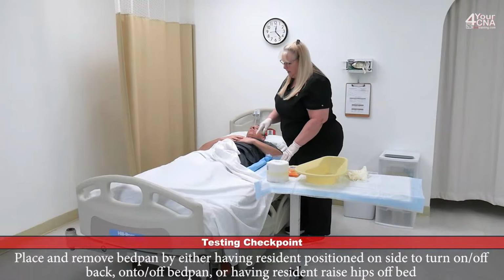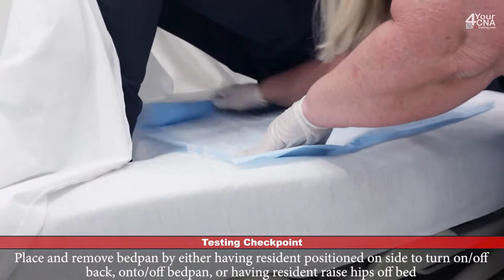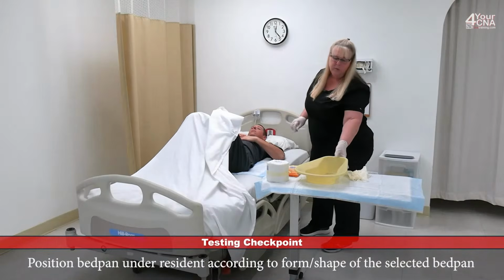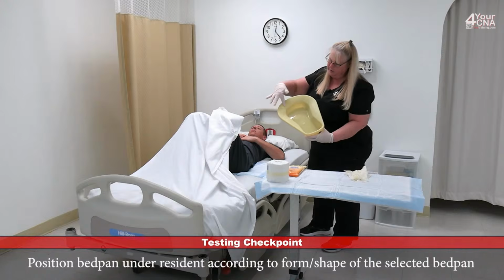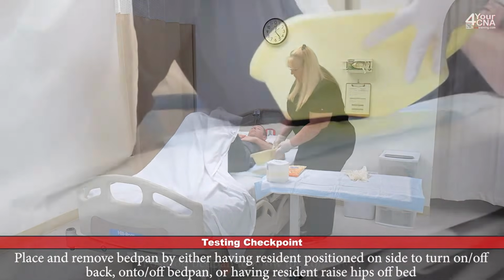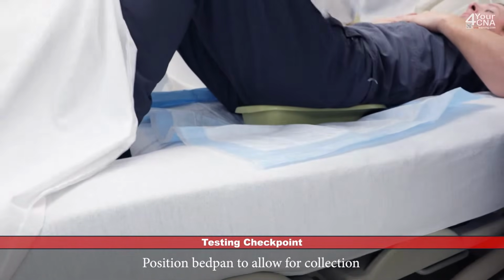Mr. Jones, can you bend your knees? And I want you to lift your hips as high as you can go. Thank you. I'll unroll that chucks all the way to the other end. Okay, you can relax. There you go. Now we're going to put the bedpan under the patient. The wider end of the bedpan goes under the patient's buttocks. So this will be toward the foot of the bed. Mr. Jones, can you lift for me? Thank you. Go ahead and come down. Make sure that that's centered appropriately.